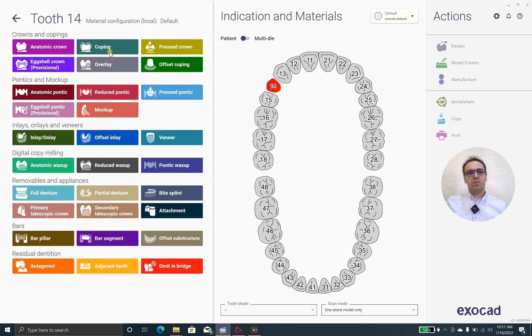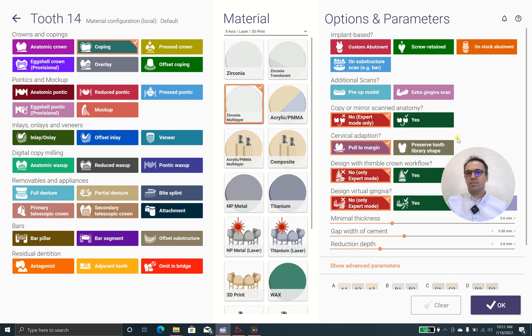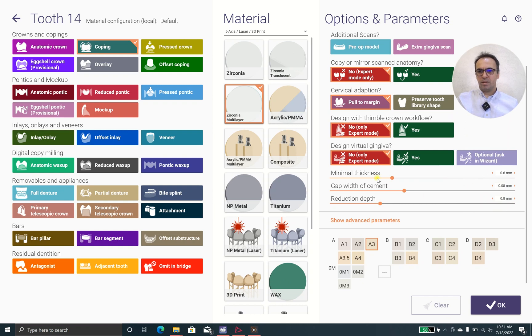In this case we have tooth 1.4. We call it Coping, Zirconia Multi-Layer. I hope it works. I prefer to choose shade A3. The minimal thickness is 0.6, but I prefer 0.8. The gap is 80 microns, which is perfect. Reduction 0.8 is fine, but I actually prefer reduction 0.4 because we use multi-layer — maybe 0.3 — because we need just a little bit of a small enamel layer on multi-layer zirconia.